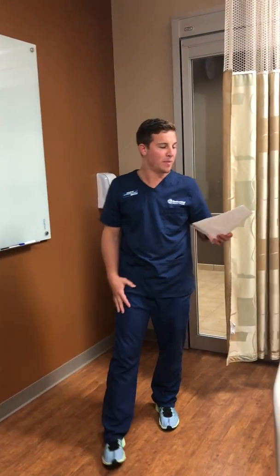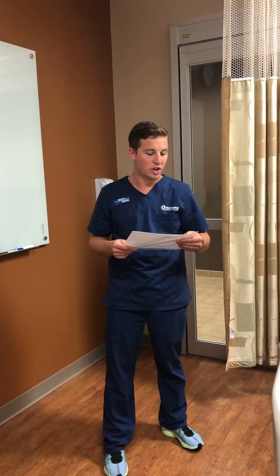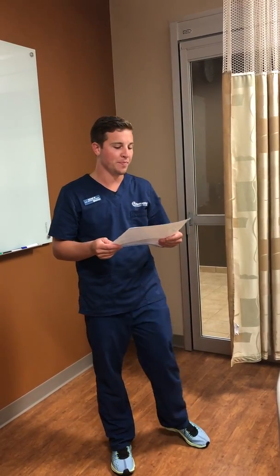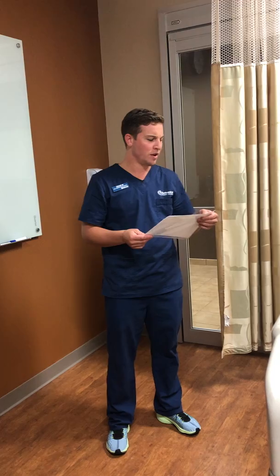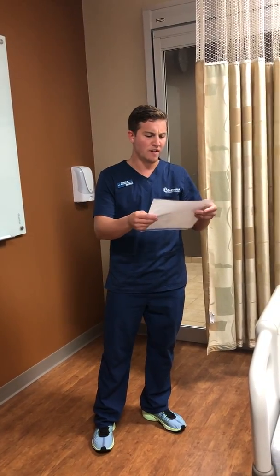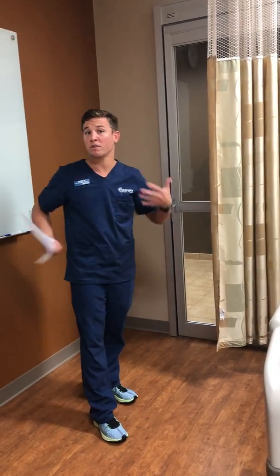So before I enter my patient's room, I'm going to look at my order, which here I have an order to do a lab draw for a CBC, complete blood count, and a basic metabolic panel, BMP. And I'm looking here to make sure that I have the right patient. Jennifer Doe, date of birth 11/5/1975, no known allergies. Lab draw. Okay, also gathering my supplies.